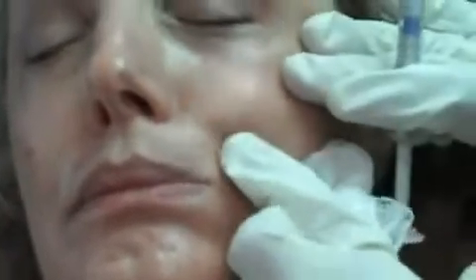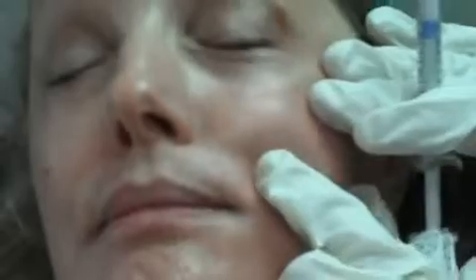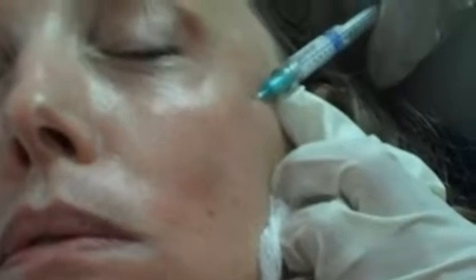Now what we will see, in addition, is the stretching out of some fine wrinkles around the face. So when I go around the lower face here, you'll see things stretch out. And of course, it always helps to have a good patient. Thank you. Open the mouth just a little bit. Great. I'm going to build up the cheekbone a little bit. We always lose a little bone mass up here.